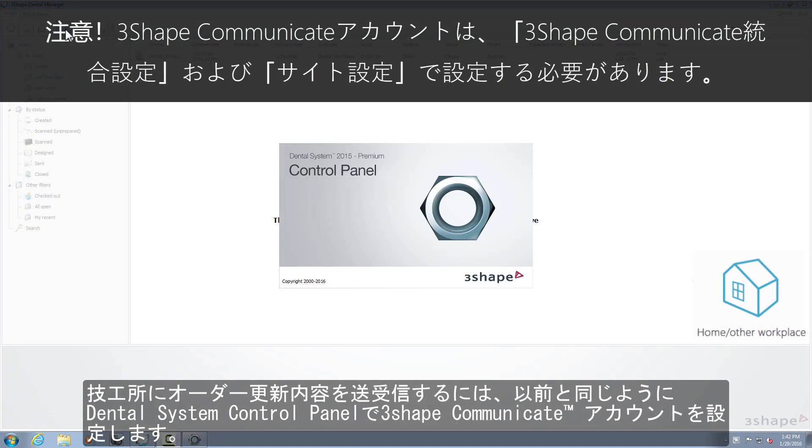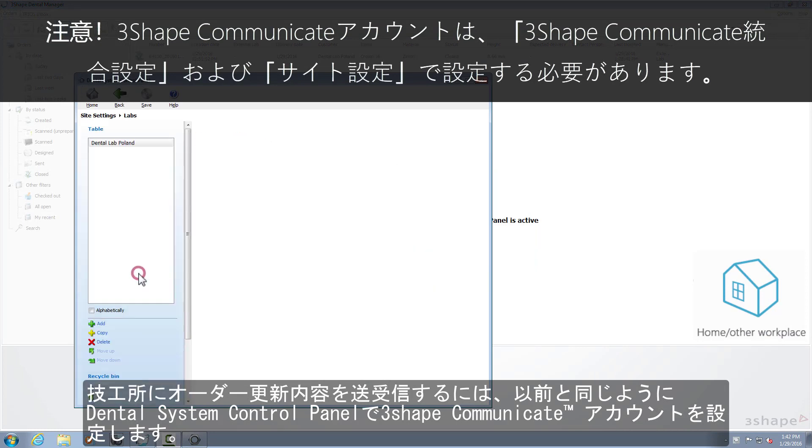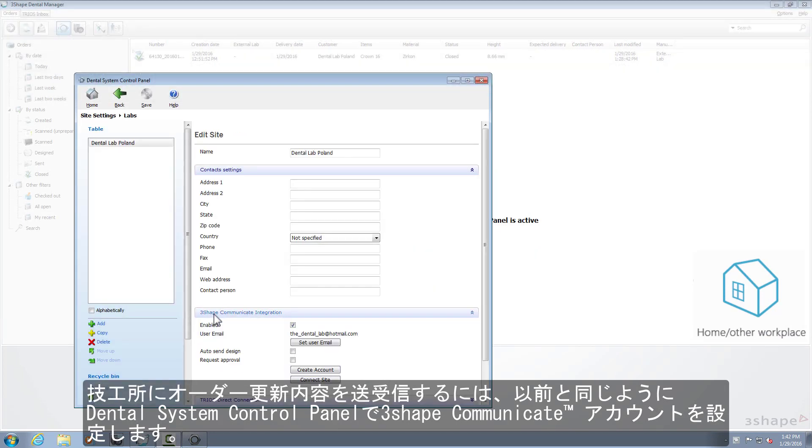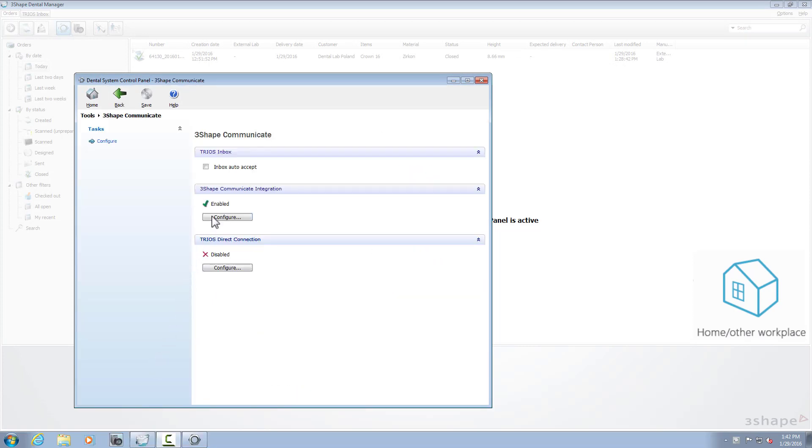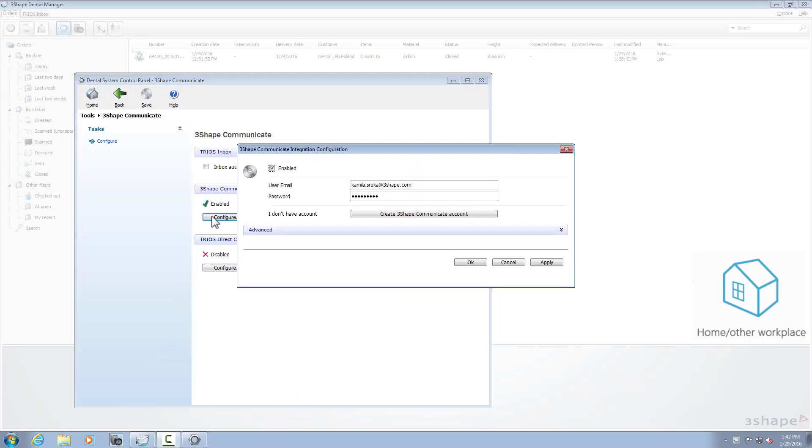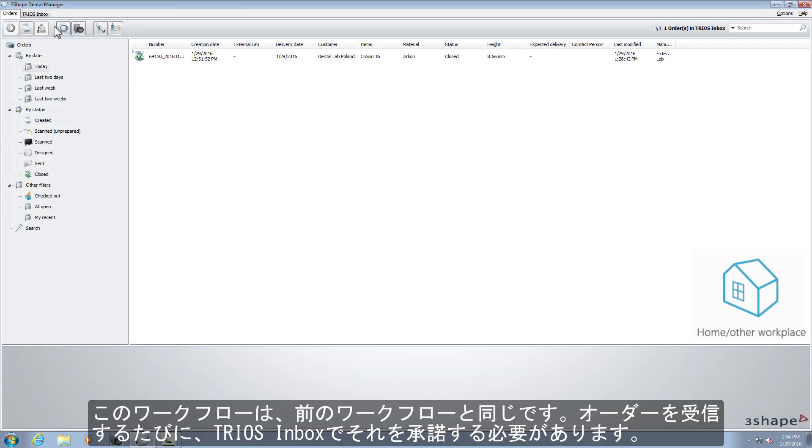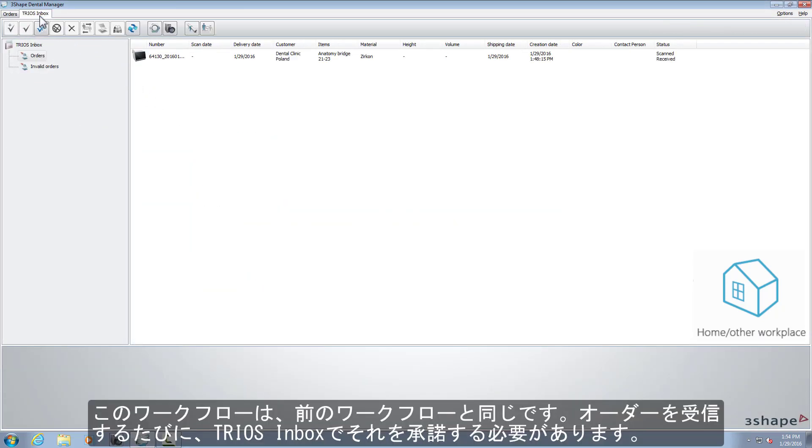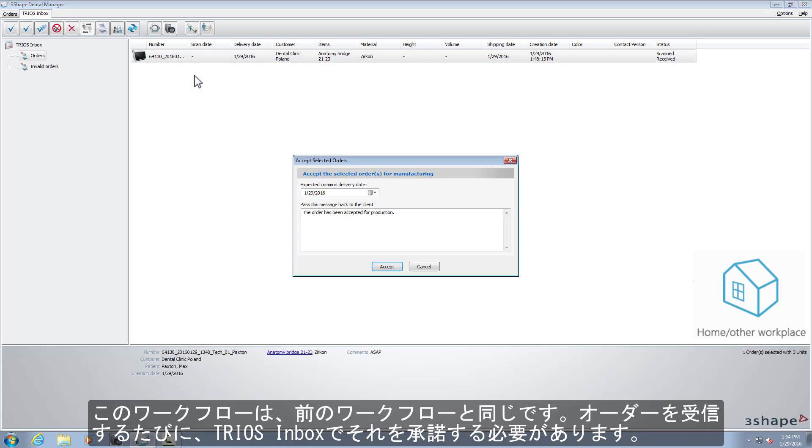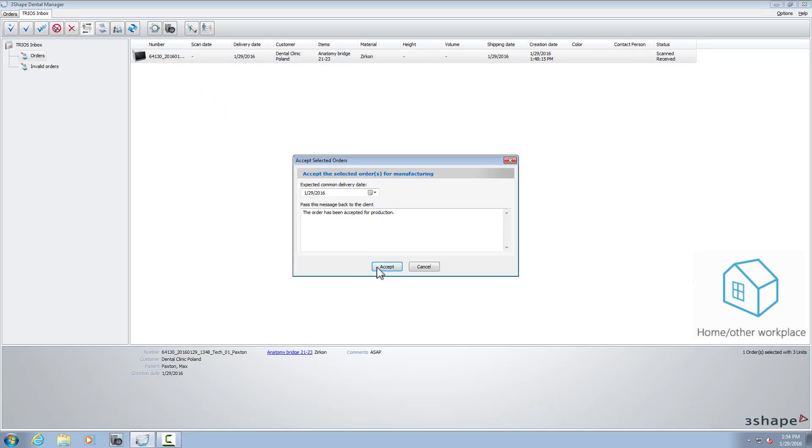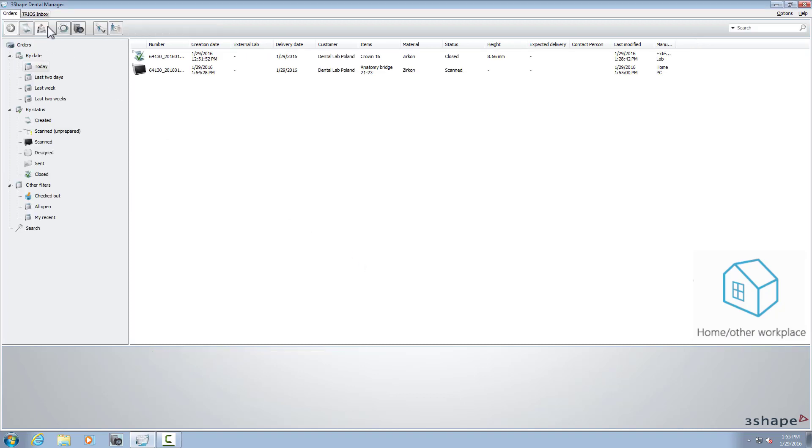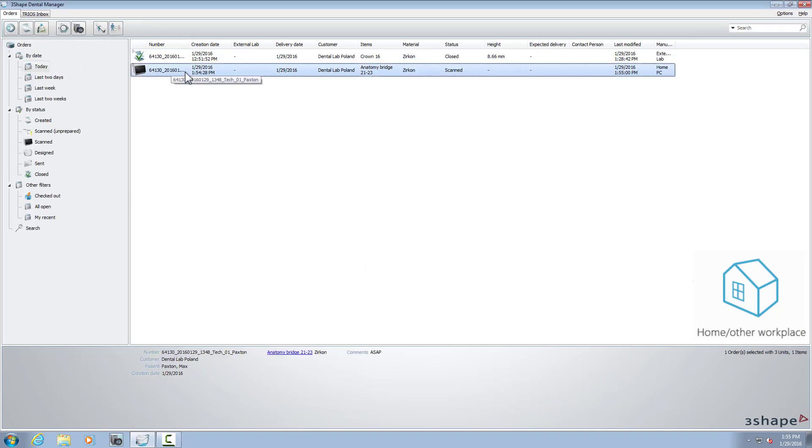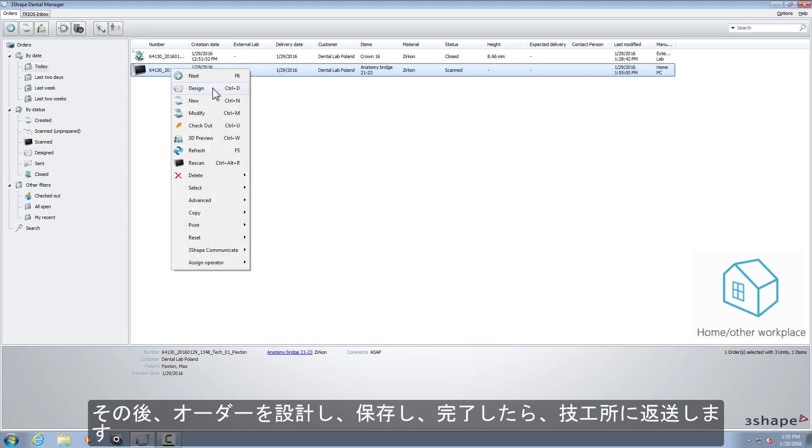To receive and send updates to your work lab, do the same as before by setting your 3Shape Communicate account in the dental system control panel. The procedure here is the same as in the previous scenario. Each time you get an order, you need to accept it in the TRIOS inbox. After that, design the case, save it, and when it's done, send it back to the lab.